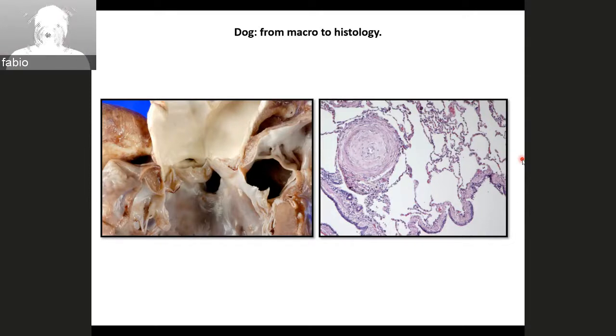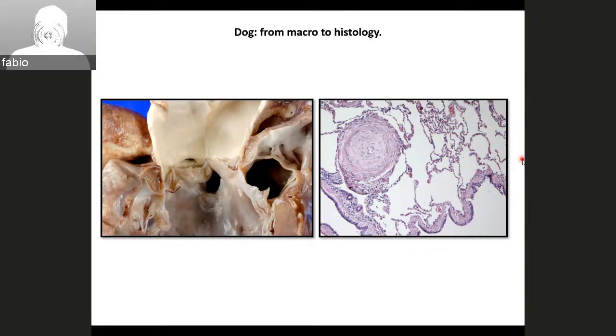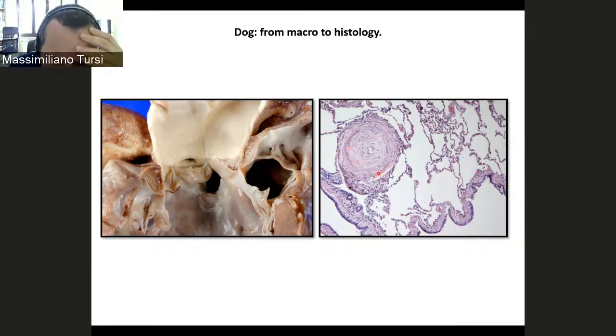What induces this kind of vascular remodeling? I thought it was pulmonary hypertension. Sure. Pulmonary hypertension. But that's not a plexiform. Plexiform is with multifocal dilatation of the wall. That's a different pattern. I mean, you may say, from your point of view, for the examination, eventually there is a severe thickening of the wall.